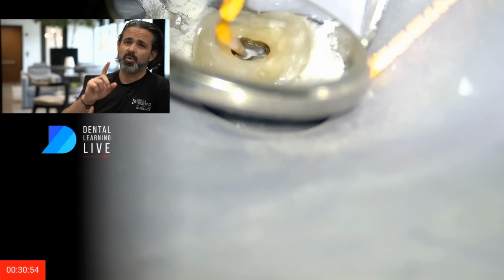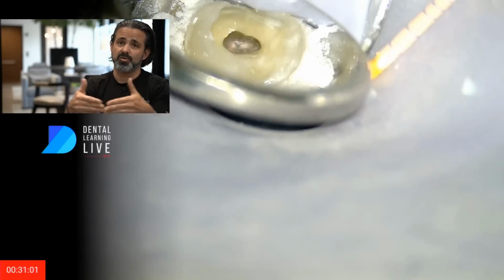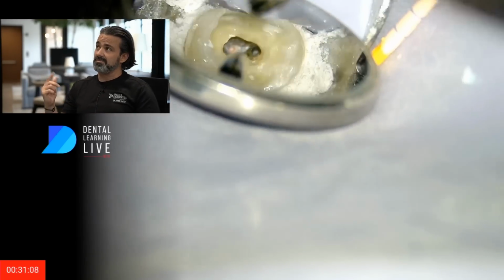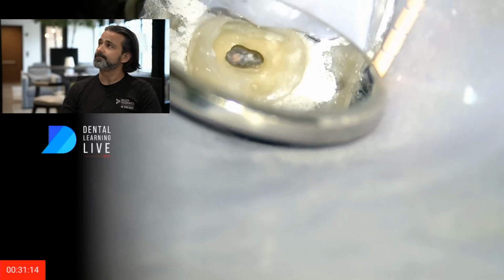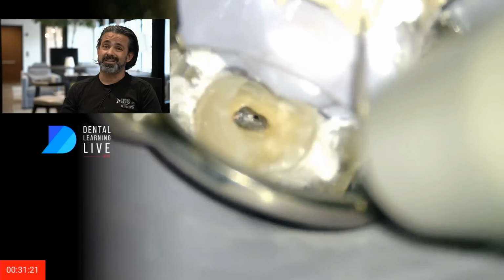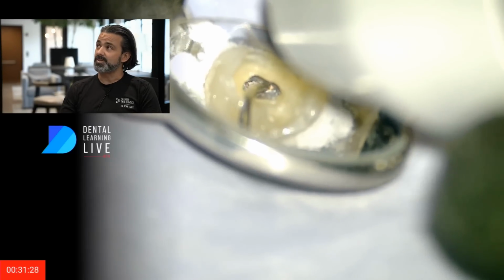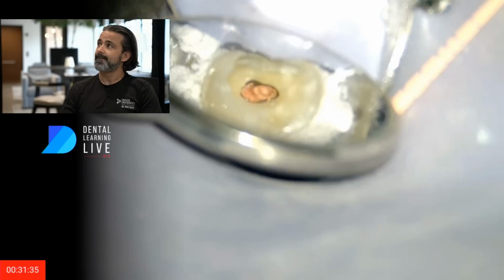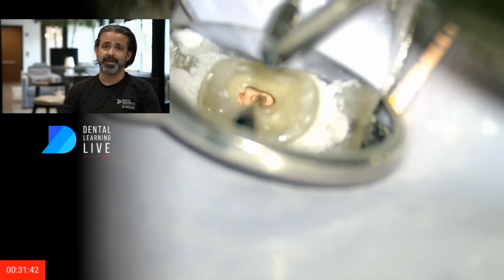And if you notice, it's the same order I did on the working length x-ray, or the cone fit x-ray, because who knows how the cones are going to crinkle and bend in that lower connection. And so I try to do everything exactly the same. And that's what I'm doing right here. So now just low down pack. And that's clean. I mean, even that kind of isthmus connection is pretty clean. And backfill at this point, you can see some of the sealer coming up. There we go, and a little bit of down pack.